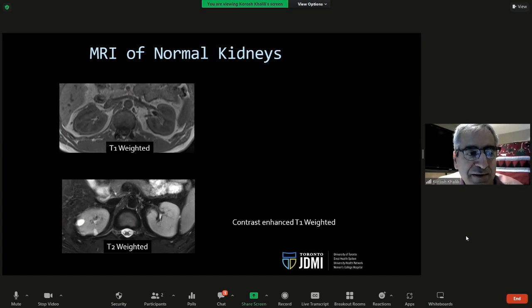So we go inside that magnet, and then radio waves are sent in and radio waves are received, and we try to excite the atoms. What we're really doing is imaging the protons, and depending on where these protons are, we image them differently. So you'll have this terminology on MRs when we're talking about T1 weighted and T2 weighted images. Basically, we're tipping the way we're imaging to show the different types of hydrogen atoms or protons.